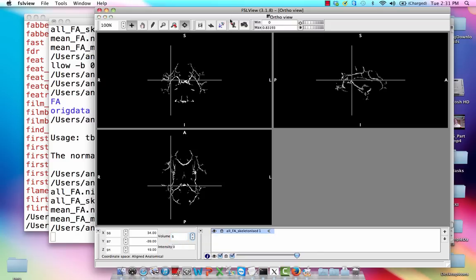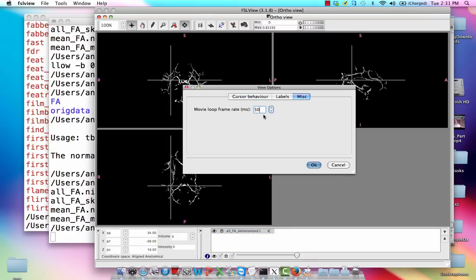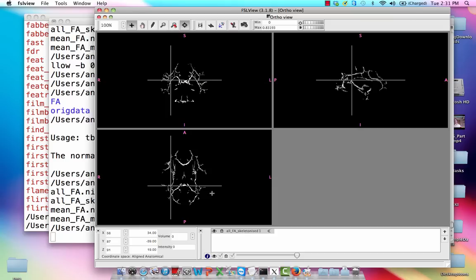Now, you could turn on movie mode if you want. Actually, let's slow it down. Let's just chill with this. Okay, so I selected options. We're going to go to the MISC tab, and let's make the frame rate 500 milliseconds.